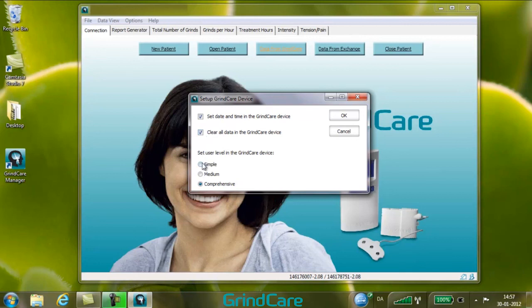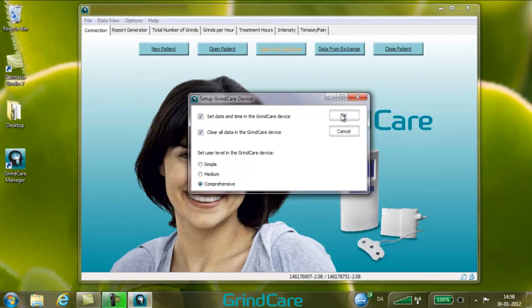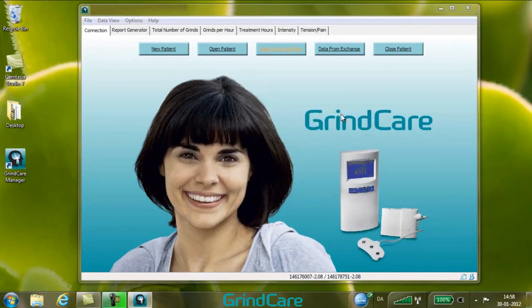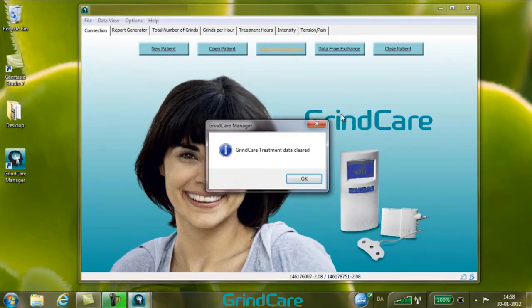Set the user level in the GrindCare device to select which menus the user can access. Simple gives access to the Treatment menu only. Medium gives access to the Treatment and Data menus. Comprehensive gives access to the Treatment, Data and Config menus. Click OK to select. After a moment, all selections have been implemented. Click OK to proceed.